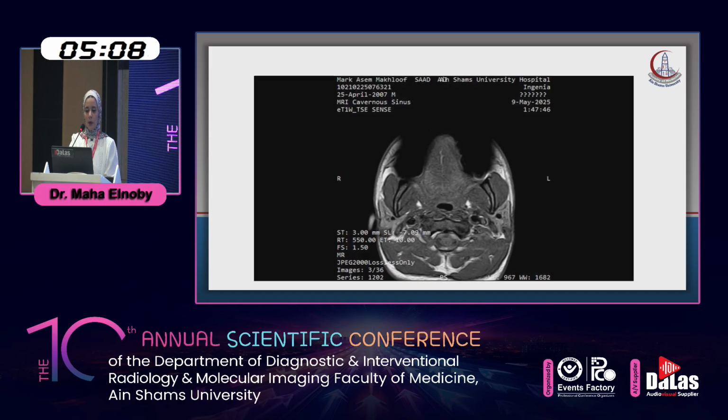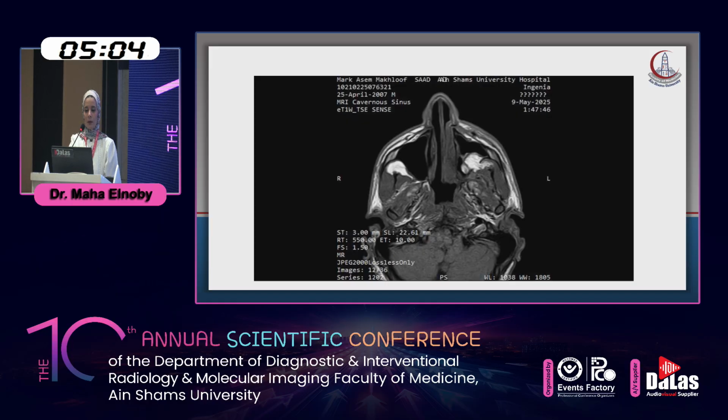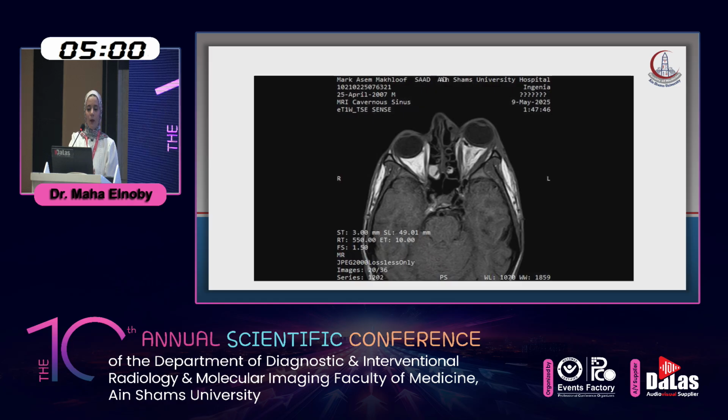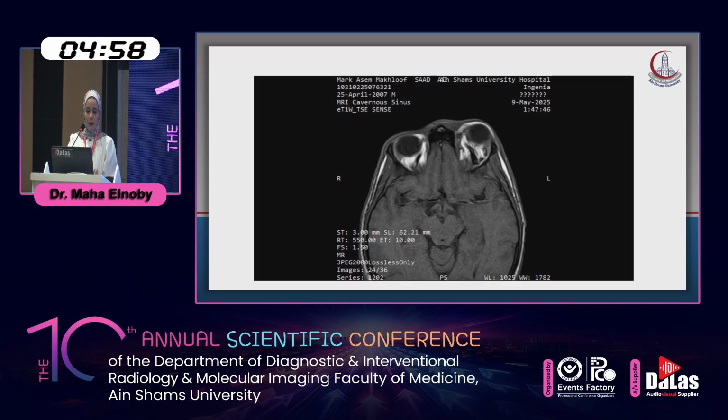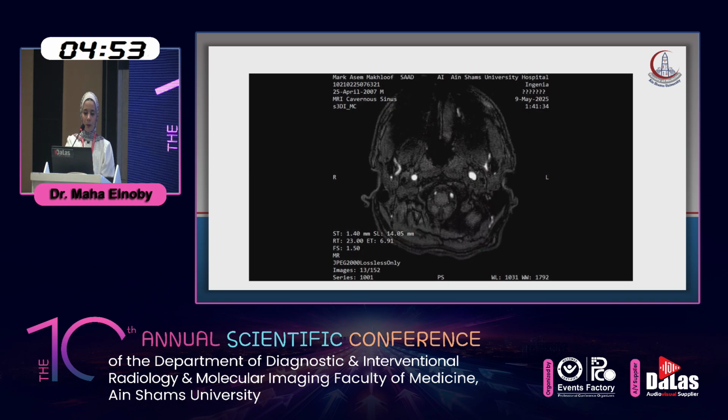T1 without contrast, the same findings. Superior ophthalmic vein with signal voids preserved, so mostly no cavernous sinus thrombosis. MRA was done.